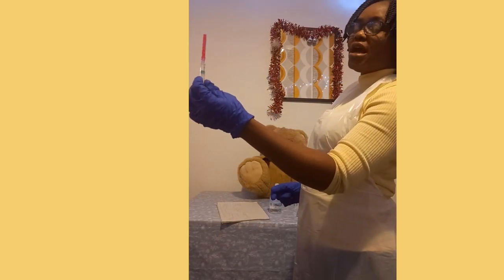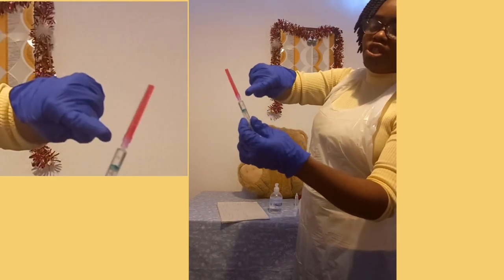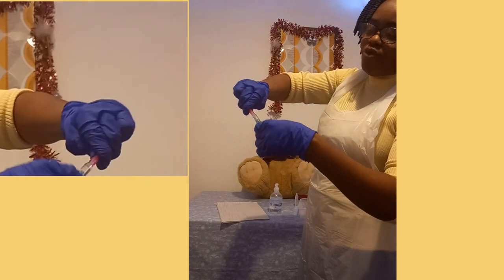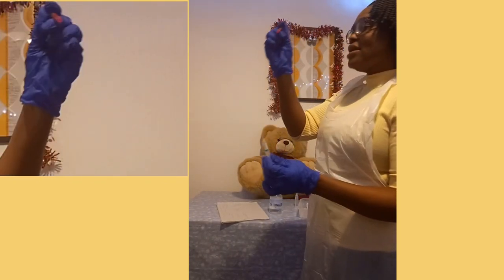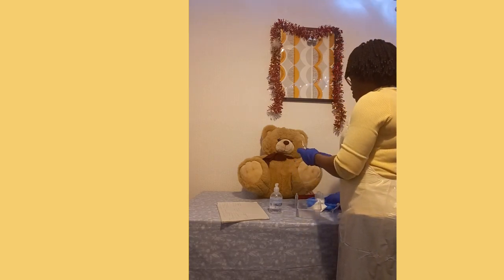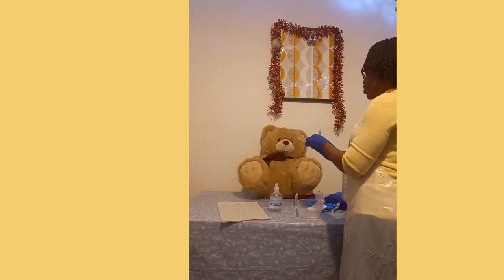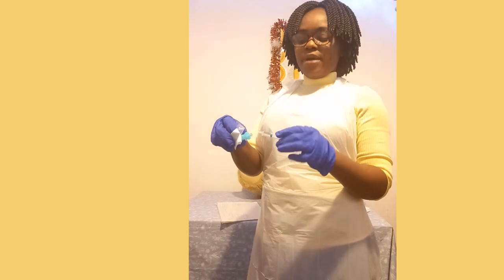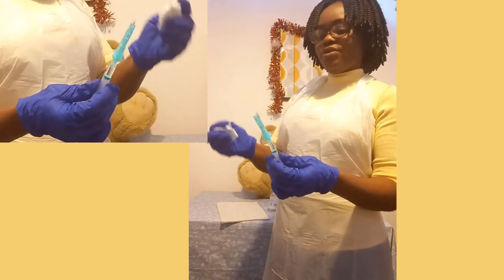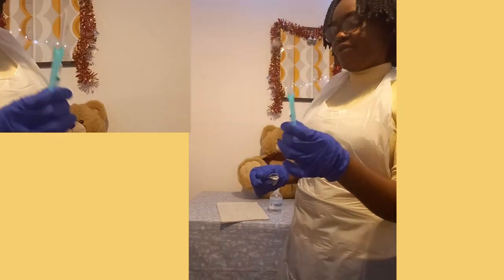Can you please confirm to me that I have 1 mL of hydroxocobalamin injection? Yes, thank you. I'm going to detach the loading needle — don't touch the peak part; hold it here, press it down and turn it to the left so it detaches with the cover. I discard it inside the sharps box. I'm going to mount my safety needle the same way I did the loading needle — being careful with the peak part so it doesn't get contaminated. I press it down and turn to the right, then remove it from the wrap.